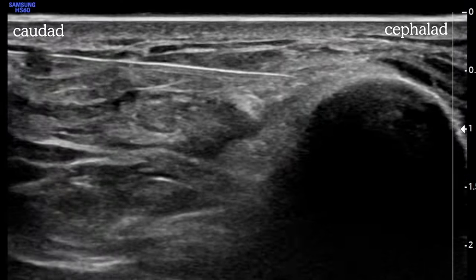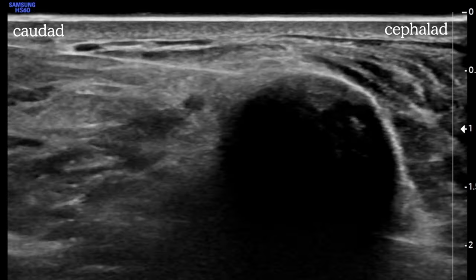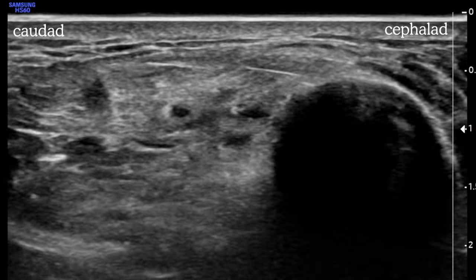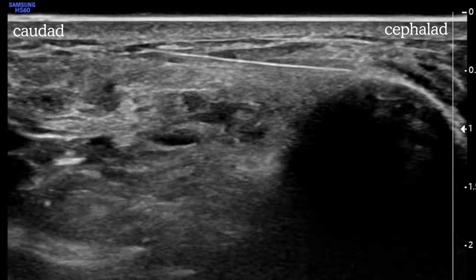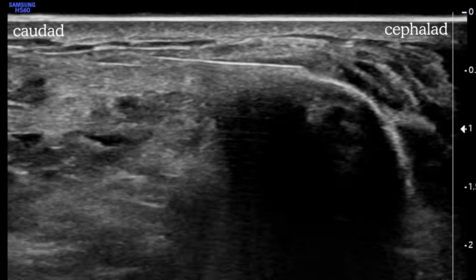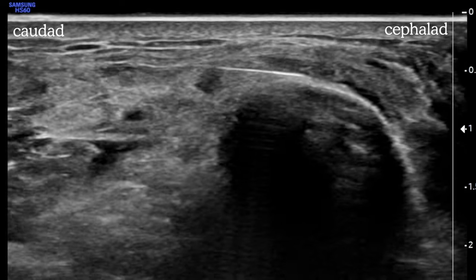Here's the clavicle with the needle approaching from the caudal aspect. We can't really see the fascia overlying the clavicle, so our goal is just to scrape the periosteum and lift the fascia up. Our first injection looks extra-fascial. We advance to 12 o'clock, and our next injection shows the fascia lifting off the bone and the clavicle being depressed. We can see it spilling down the cephalad side, which is a good sign. We'll stay here and deliver our whole bolus.